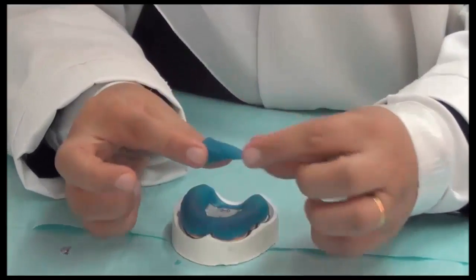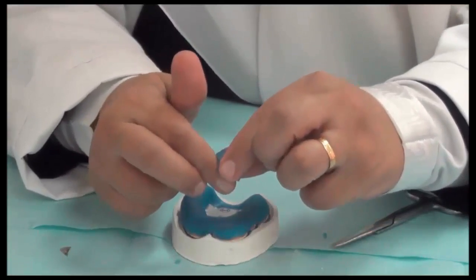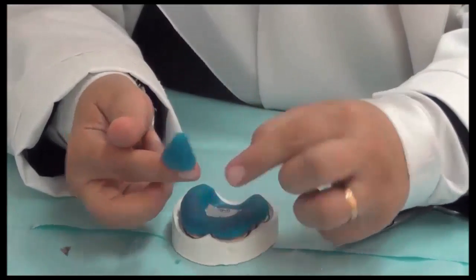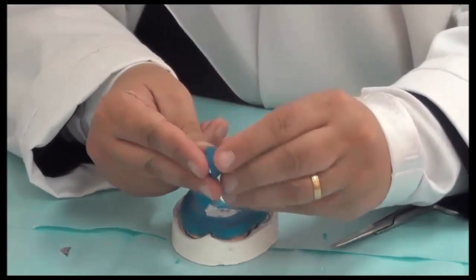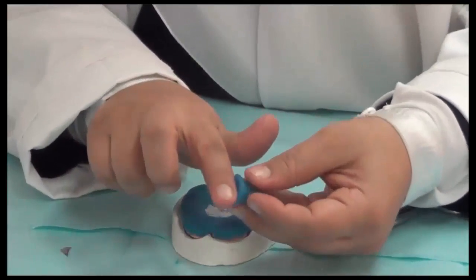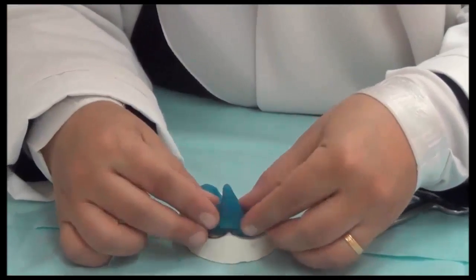We make the base a bit wider than the upper part. This will allow us to adapt the tray handle to the tray body well. So first of all, we made it wider from the base than the tip of it, and we press it like this, so we could adapt this easily to the tray from beneath.